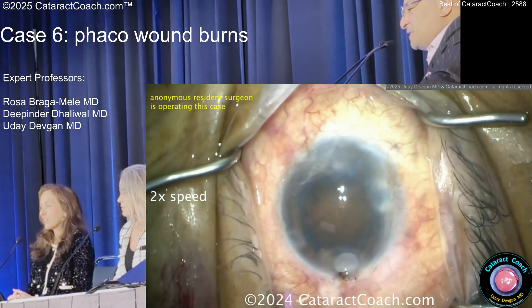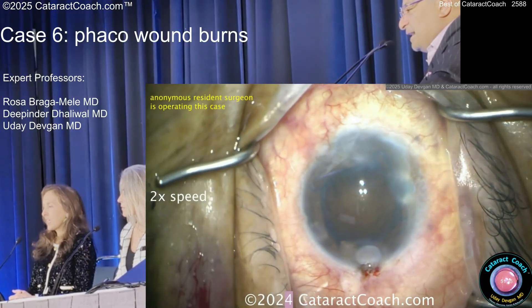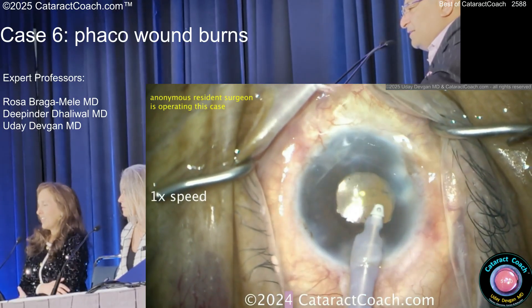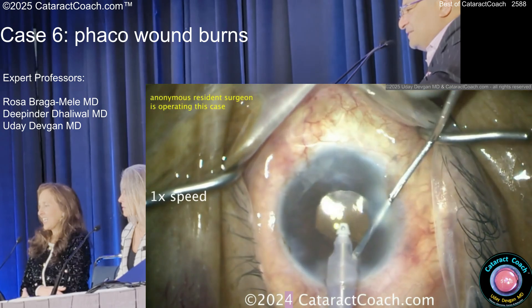Here's another FACO wound burn — end of the case. Same kind of issue here. Now what's going to happen with that extra leaky incision?